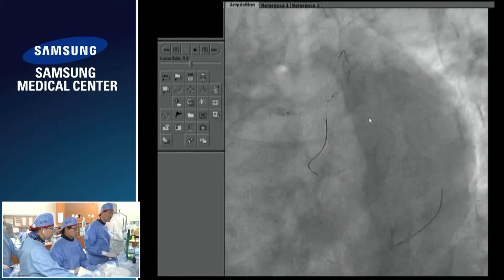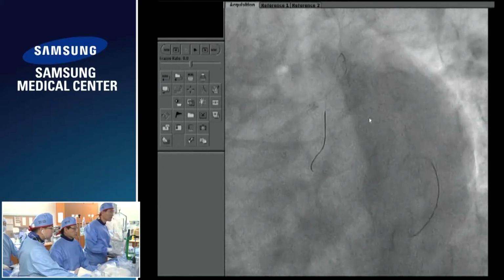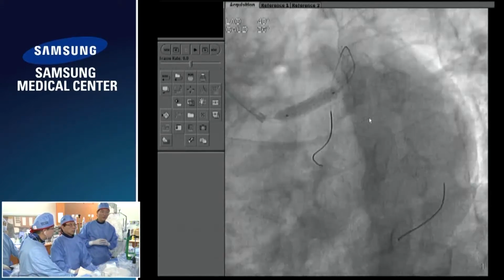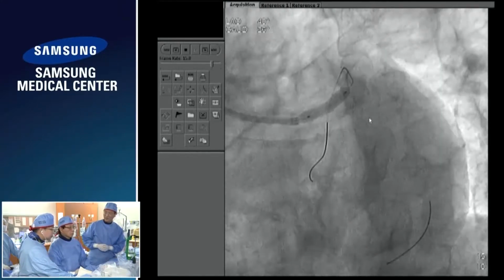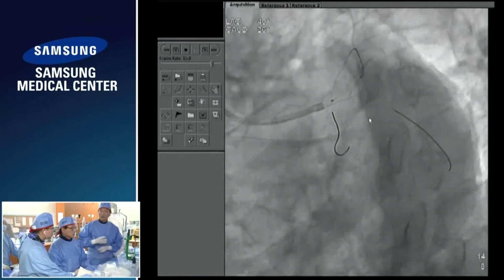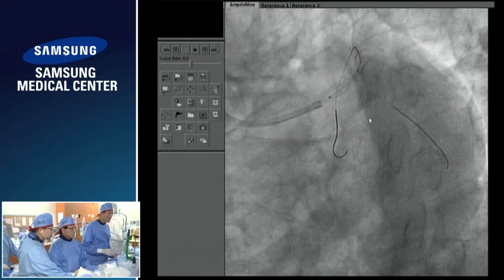You usually do the POT after side branch wiring, Dr. Gwon? Yeah, because sometimes with the POT we miss the exact location of the balloon. It'll compromise the circumflex ostium. This is disastrous. So, if I try to rewire before POT, it fails. I do the POT. So it's a modification of the guideline actually. So angio, yes.